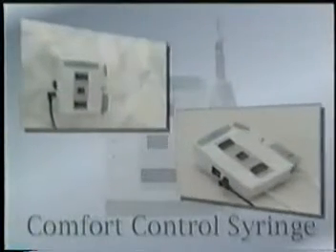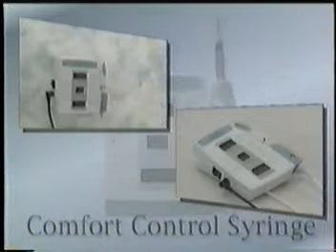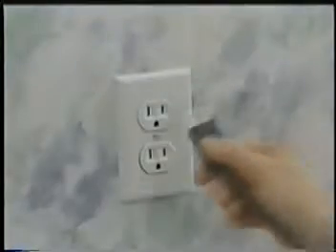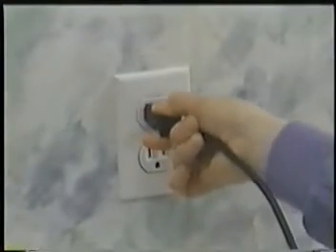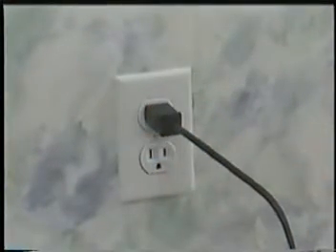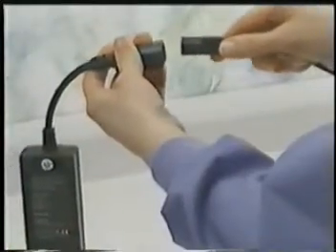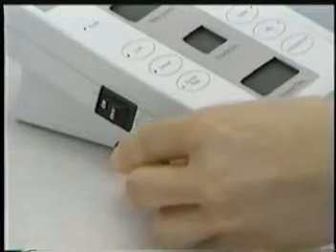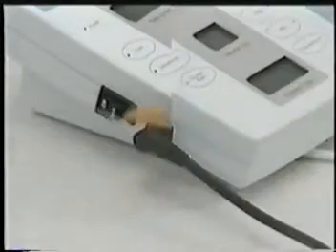Whether you choose to locate your CCS on the wall or counter, you will have the flexibility to easily move the unit from room to room. The compact size of your CCS allows easy placement anywhere. To continue setting up the CCS, simply plug one end of the AC power cord into an outlet and the other end into the external power supply. Then, plug the low voltage cable into the CCS control unit.